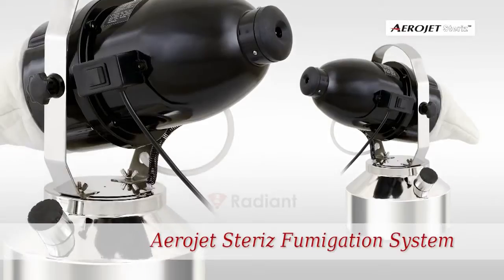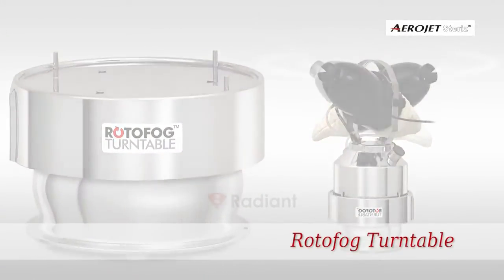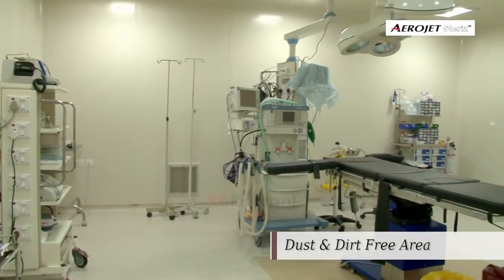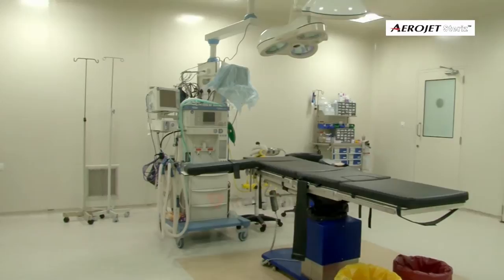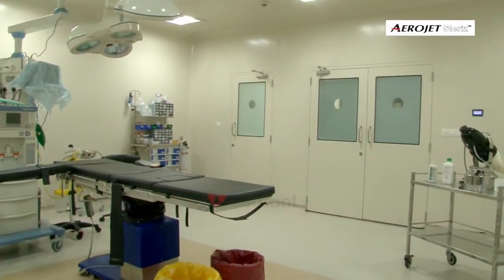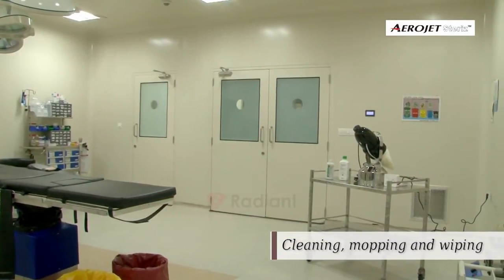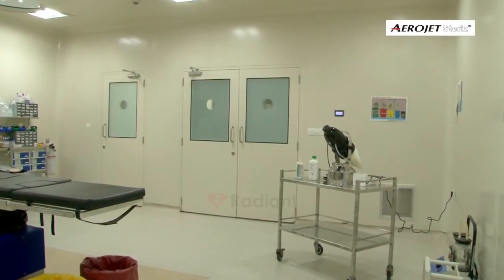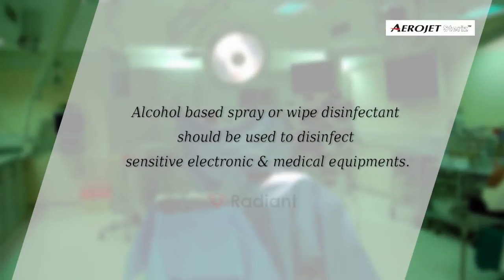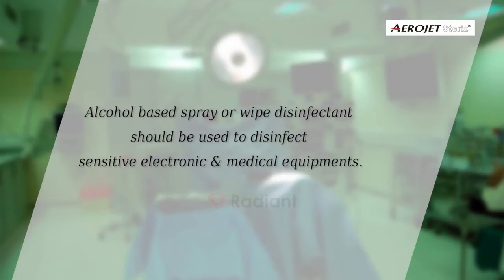Please follow the installation process of Aerojet for airborne disinfection of the treatment area. The treatment area should be absolutely dust and dirt free, and subjected to a thorough bio cleaning process which includes all accessible and inaccessible surfaces subjected to cleaning, mopping, and wiping with recommended disinfection solution. Alcohol-based spray or wipe disinfectant should be used to disinfect sensitive electronic surfaces.